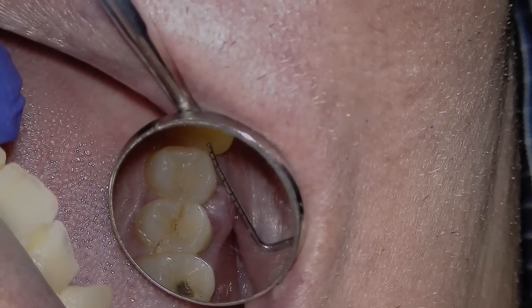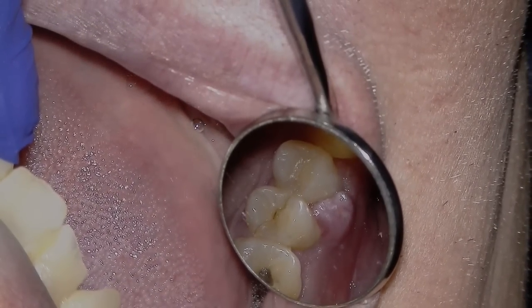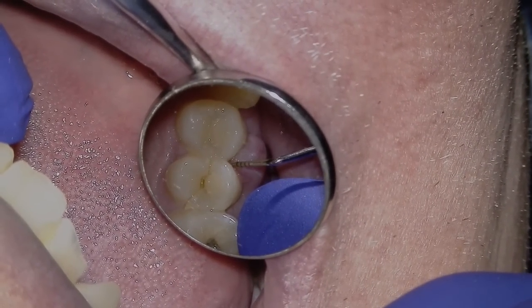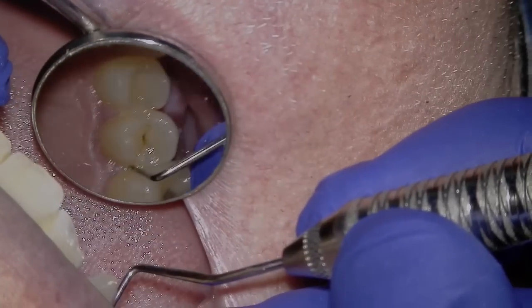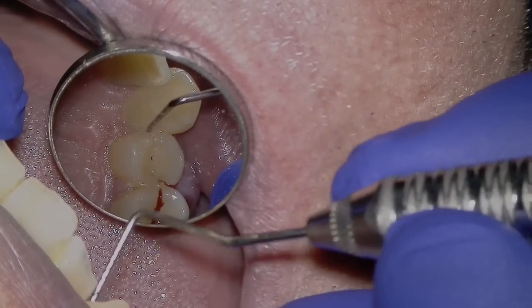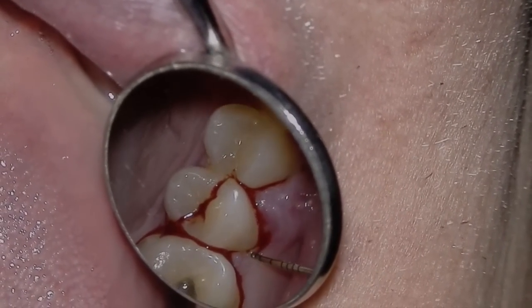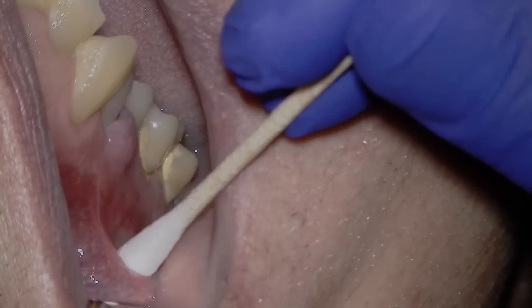Here we're going to continue with our endodontic exam. I have my perio probe in my hand — that's the gingival abscess. The patient's been on antibiotics for a week, prescribed to him previously. I get a maximum of 6 to 7 millimeters, as his tooth was pretty sensitive and he didn't want to be probed too deeply. Had I anesthetized the patient, likely I could have gotten a deeper probing depth, especially where the split goes right through the tooth. What I'm checking for here is on the number one form to see if there are any cracks going down to the osseous level.